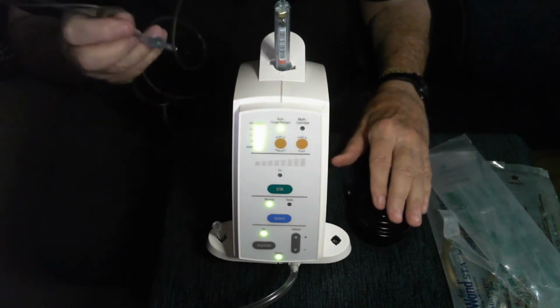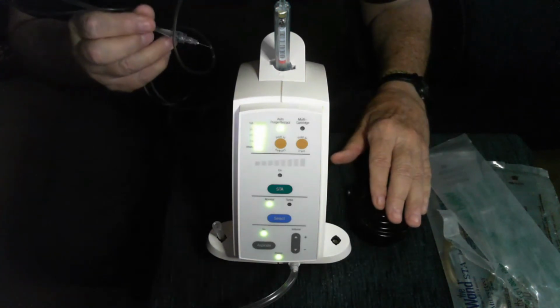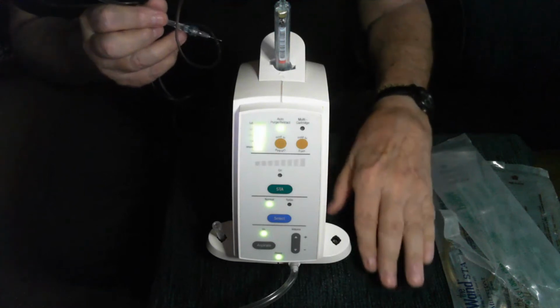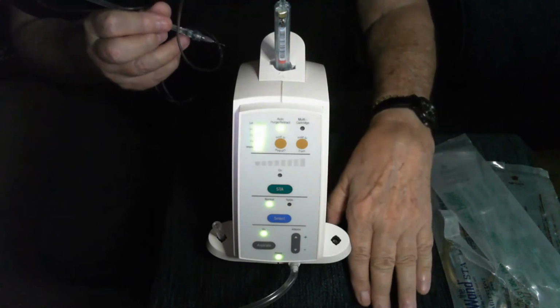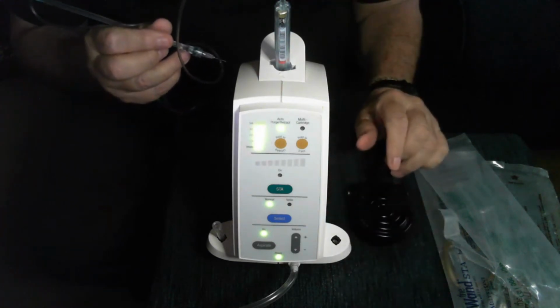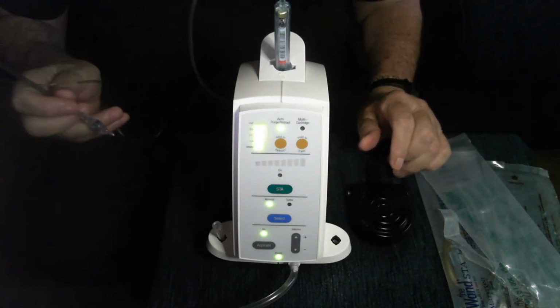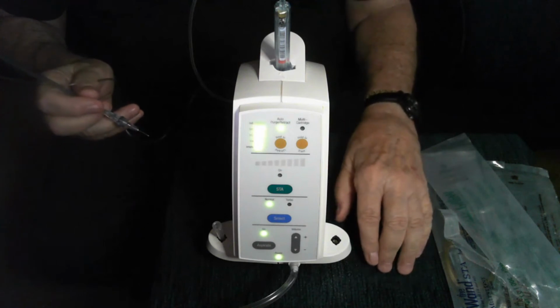So if I'm giving a mandibular block, for example, I'm going to rotate the needle back and forth till I get to the injection site, in which case I will hit the foot pedal and go into aspiration to determine if I'm in a blood vessel. And if I'm not in a blood vessel, then I can go to the rapid flow rate.